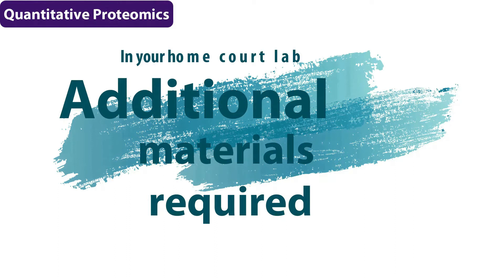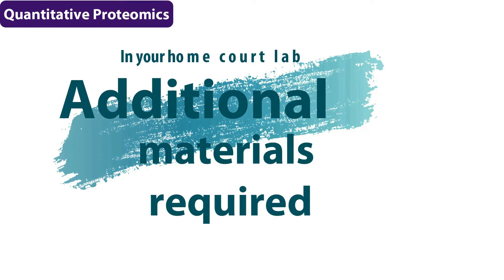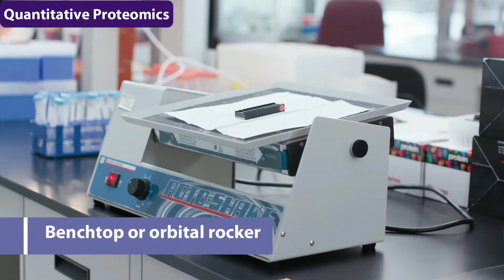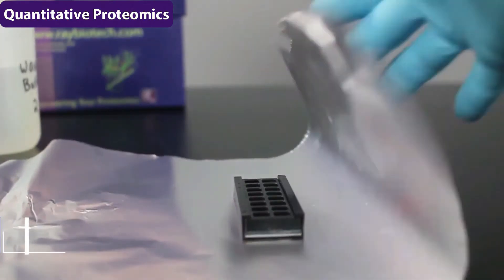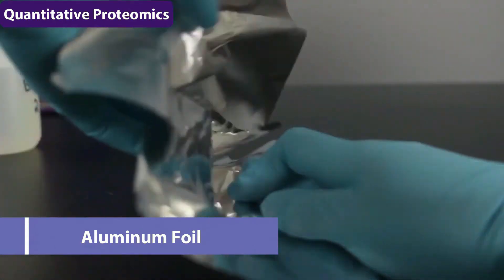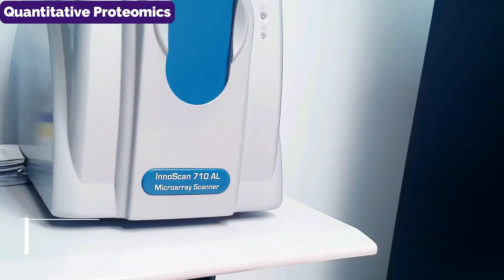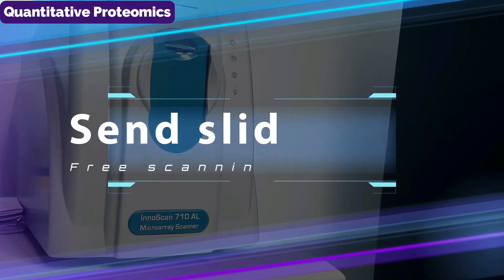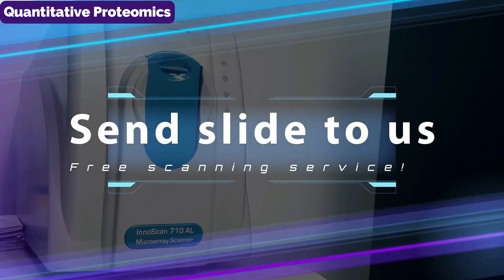In your home court lab, there are a few additional materials that you will need. These include a bench top orbital shaker or rocker, aluminum foil that we're going to use to protect our fluorescent dye, and a microarray scanner. If you don't have a scanner, that's okay. You can send us your slide, and we will scan it for you for free.